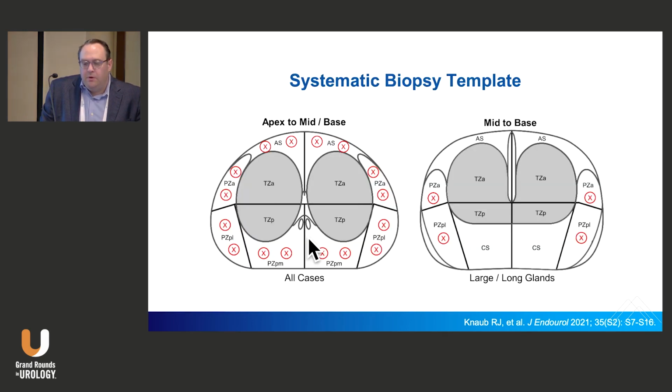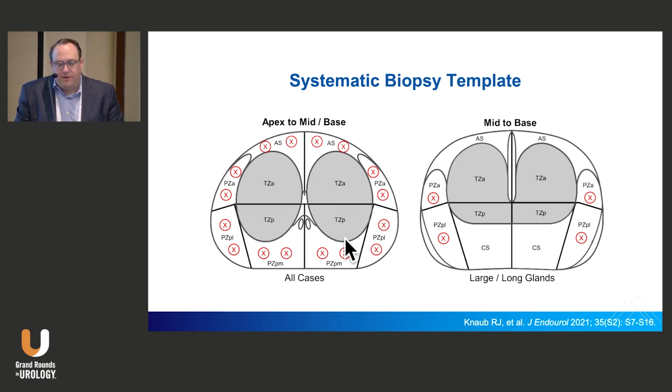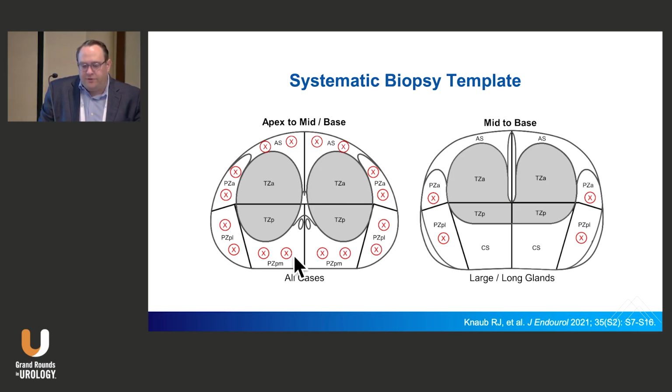So I get asked a lot of questions about what template I use for performing transperineal prostate biopsy. I use what's called the 10-sector technique, which was popularized again by Dr. Alloway at Perineologic. And he did these very careful studies where he did a full 20-core biopsy and then looked to see the yield versus 18 cores versus 16 cores and so forth, and found that really the optimal number is 20 cores, where you basically break the prostate up into 5 sectors on either side. You're basically going throughout the entire peripheral zone of the prostate and then anteriorly up through the anterior fibromuscular stroma.